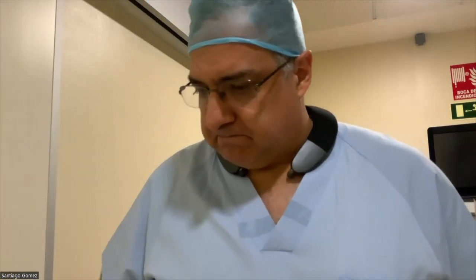Okay. So what's your strategy? Why is en bloc still the best? I joined your operation at the end when you were doing the morcellation, and why do you think that en bloc is still the best? Well, I think the en bloc technique has many advantages. The first one is that it's simple to understand, because it's like peeling an orange circumferentially.